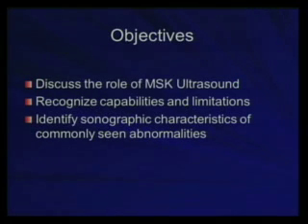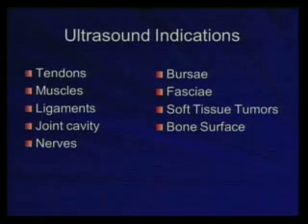So these are the objectives of the presentation. We will discuss the role of MSK Ultrasound. We will check the capabilities and limitations, and we will see some common abnormalities. So we use ultrasound to evaluate all these structures that we will see one by one.